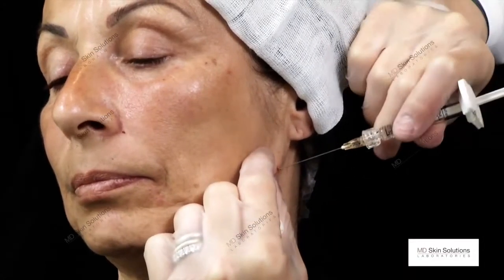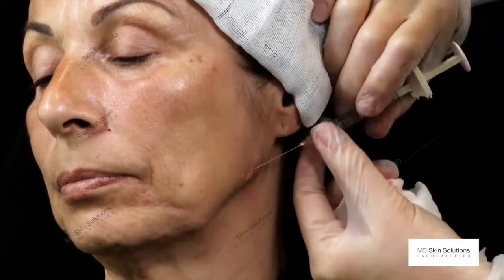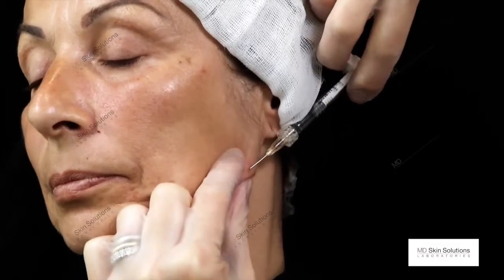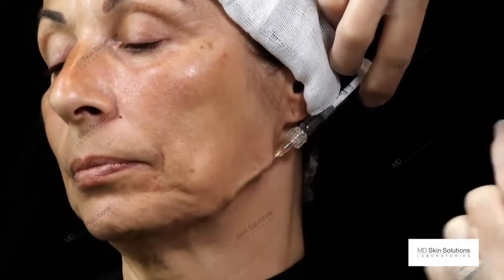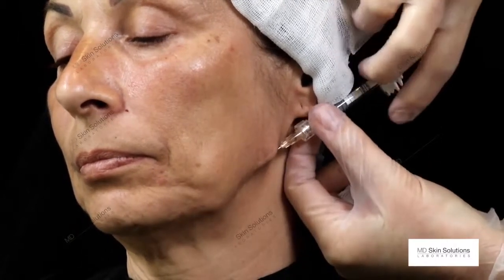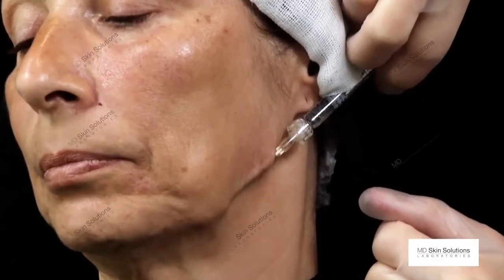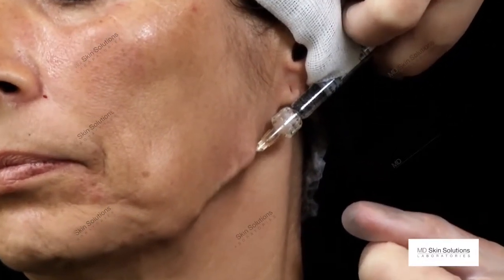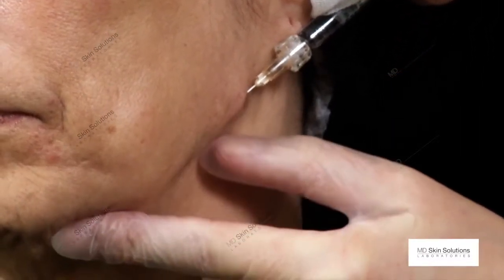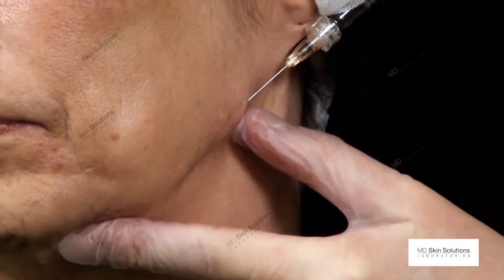Again, I pinch the skin, insert the tip, and now I do navigate in the subdermal level with my index finger and the thumb in order to place the cannula in the right level, in the subdermal level. And now I do place the filler on the bone in a retrograde fashion again.